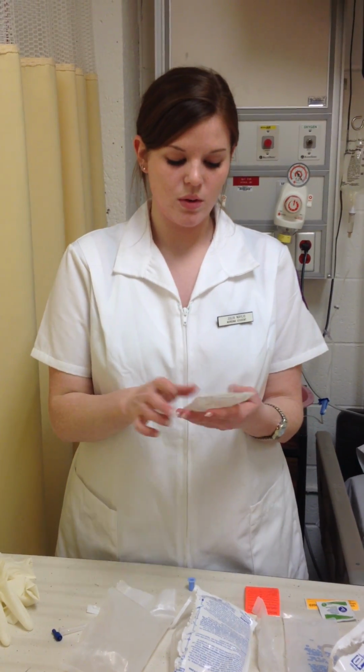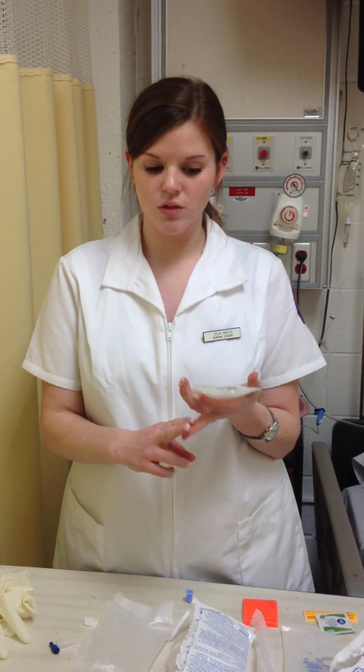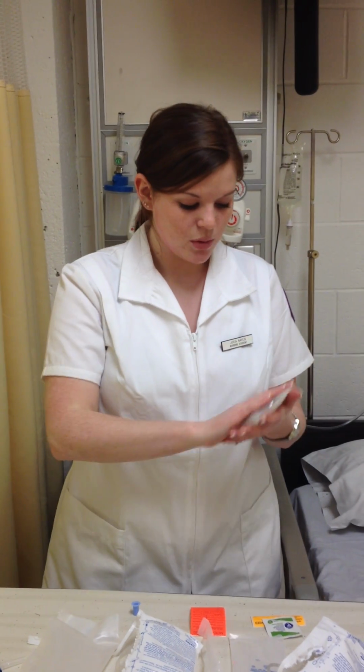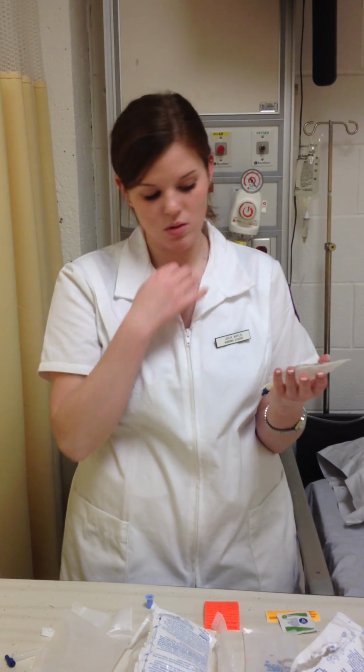medication IV, and I'm going to say my 6 rights, which is right dose, right drug, right reason, right route, right patient, and right time. And then I'm going to make sure it's not expired, and I'm also going to stamp a tubing label onto it. And then I'm going to check this medication with the MAR that the doctor ordered.